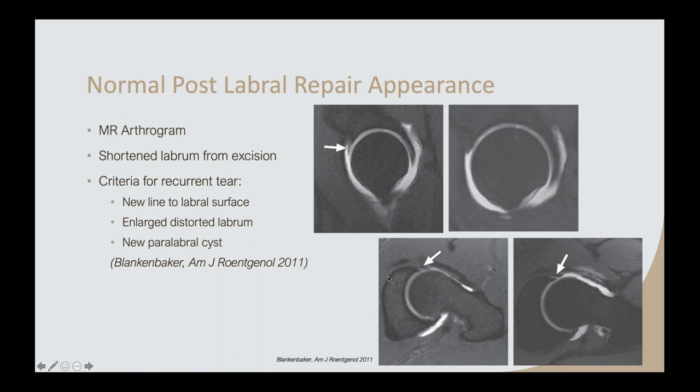So these two images at the bottom, axial obliques, post MRI arthrograms, you see that in the pre-operative image, there's a slightly more oblique tear line. And in the post-operative images, you see that this is a different type of configuration of the linear line. This is more horizontal. So this is diagnosed as a re-tear. Patient went back for a repeat arthroscopy and that was confirmed.